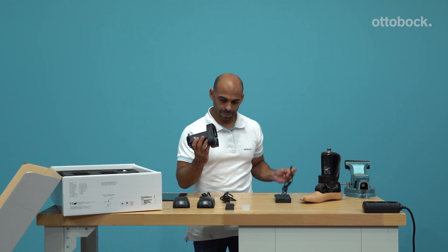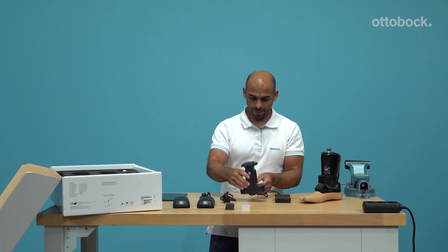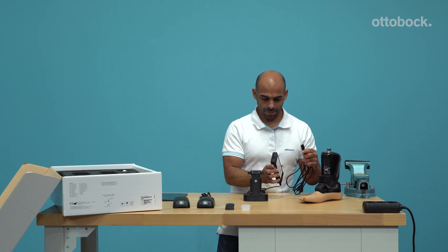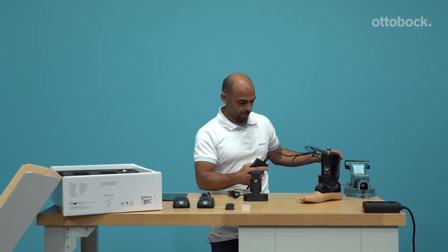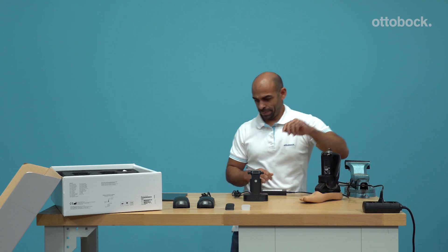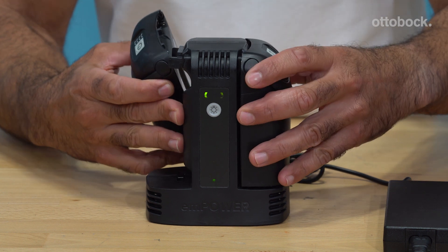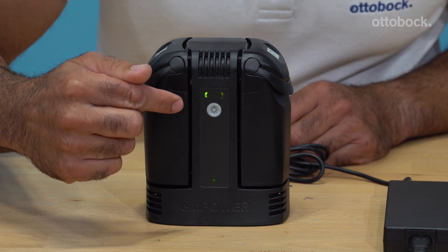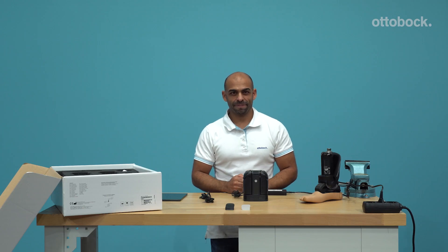To charge the Empower, please connect the power supply and cord to the battery charger and connect the plug to a readily accessible outlet. The battery charger can charge two batteries at the same time. The LED lights will illuminate as soon as the battery charger is supplied with electricity. It takes roughly two and a half hours to fully charge both batteries.